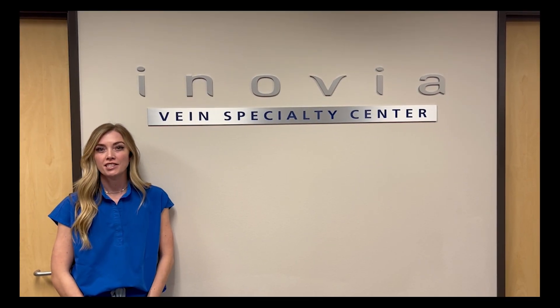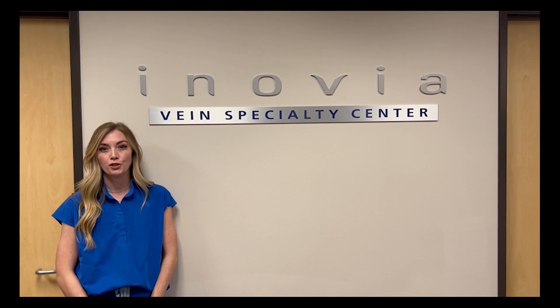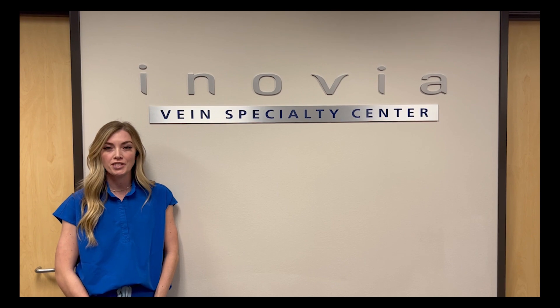Hi, my name is Shelby and I'm here today to teach you some tips and tricks on how to put your compression socks on at home, as they can be difficult at times.